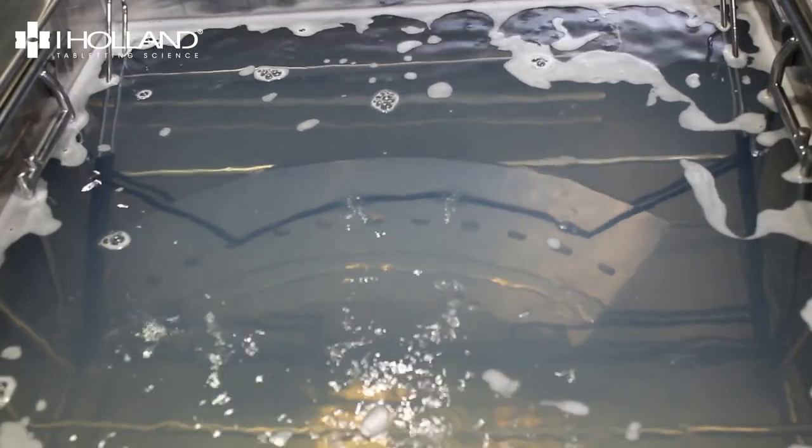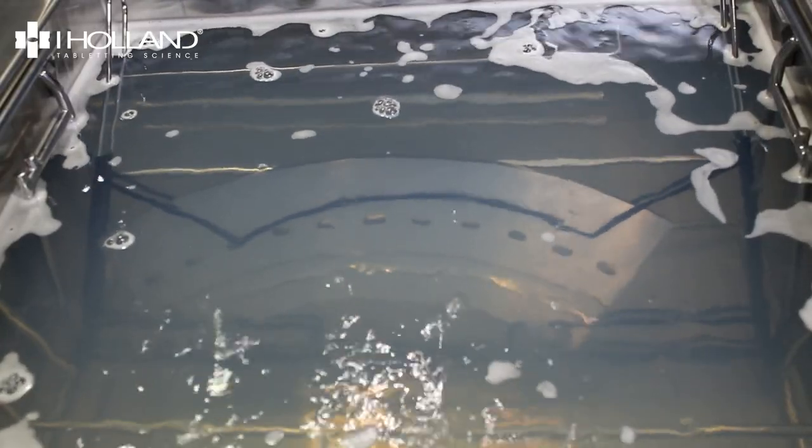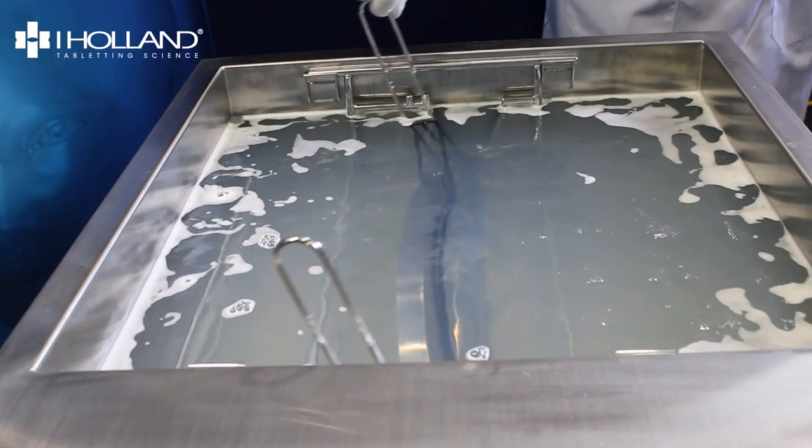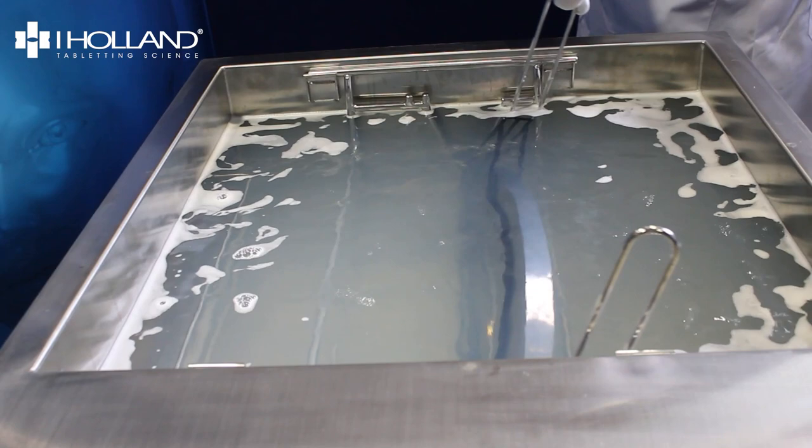Set the cycle time to 5 minutes and press the ultrasound button to start the cleaning cycle. When the cycle time is complete, pivot the basket to the opposite face and run the cycle again.